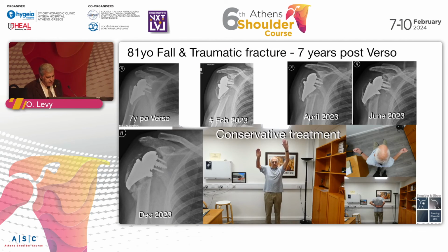Again, this is another gentleman. He's not from this series because he's only 7 years after the operation. This is how it was. For 7 years, I was delighted. He fell in February. He went to see someone else that wanted to revise him. I said, no, don't need to revise. We can treat you conservatively. And you could see him. This is in last December.